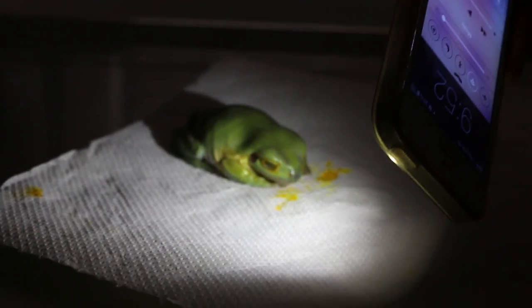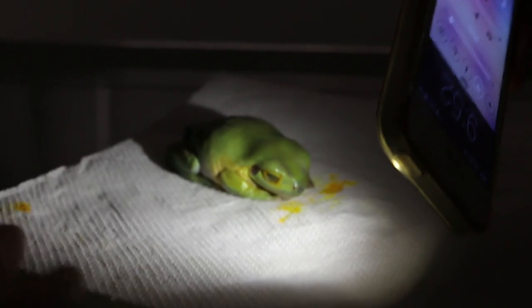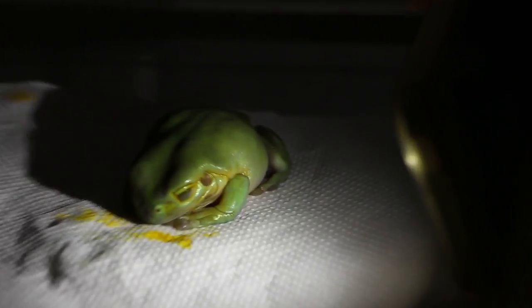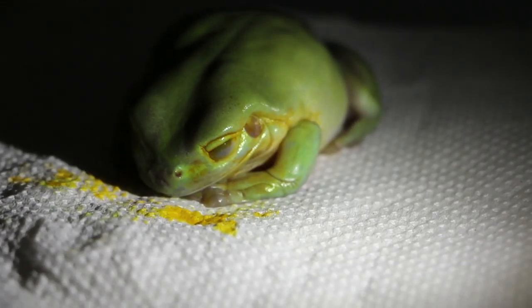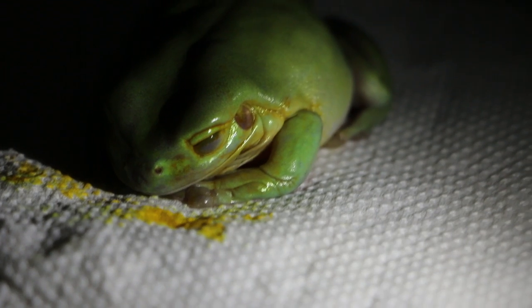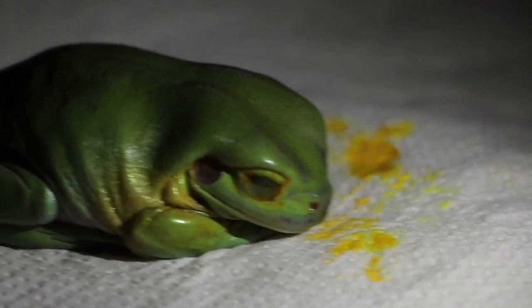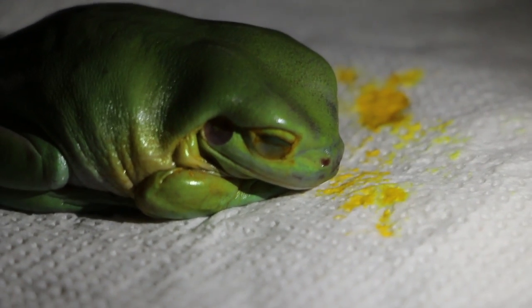Direct — up a bit. Come this side a bit. You can see or not actually? I can see, yes. No, I mean — can the frog see or not? I don't think the frog can see. It's actually lying down, very still. Usually it would jump to a spot when put in a high spot, but this time it's not jumping anymore. What happened is the eyelid — it's definitely swollen, that's why it can't close. The black iris — the pupil — that's what you're talking about, right?